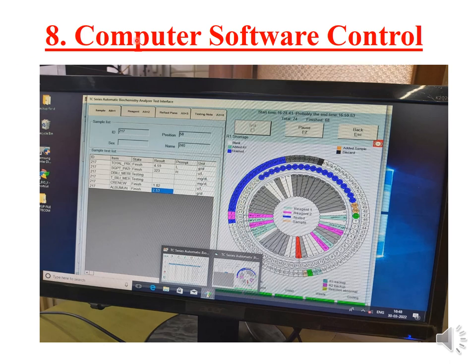The final and among the most important parts is the computer and computer software control. All the information is fed here and then the program is run every day for various samples to be analyzed. Blue marks here indicate that the tests are done.